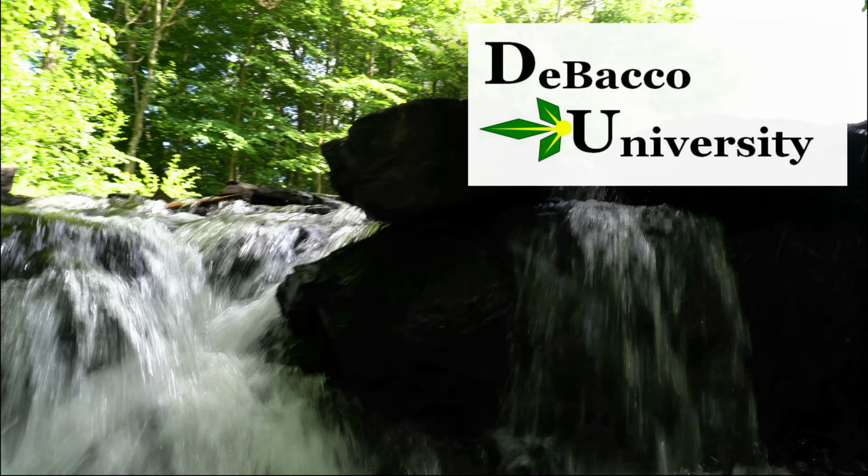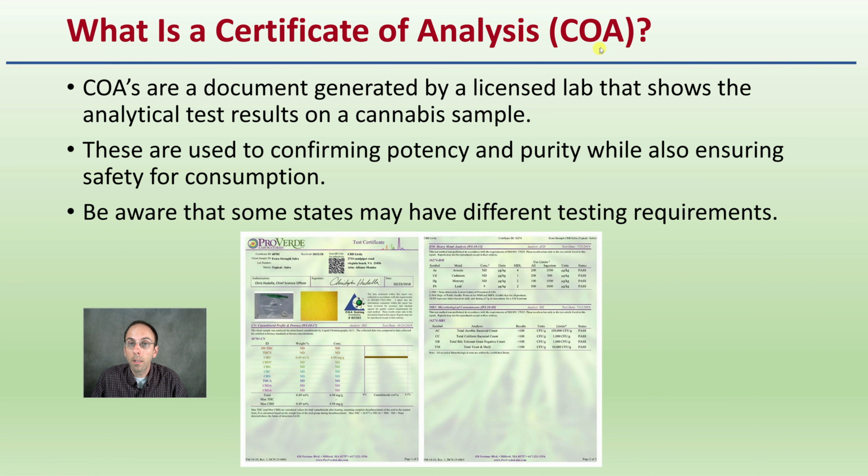All right, so here we're going to go about reading and understanding an analytical report for cannabis products. It does apply to a whole host of cannabis products, not just dry flower. So what is this certificate of analysis, typically abbreviated COA? Well, COAs are a document generated by a licensed lab that shows the analytical test results on a cannabis sample.